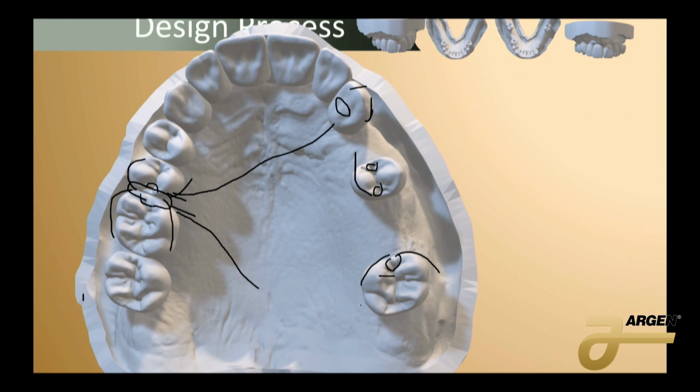On a case like this, I'll be honest, I haven't seen too many of these, and when you're getting into designing frameworks, I urge you to go online and look at some of the masters who have made YouTube videos. They have a lot of creative ways to make a nice major connector. I don't really think that every major connector has to have a serious name. We're just connecting the parts, right? So it doesn't necessarily have to be called a strap or a horseshoe. If we're designing our own cases, we just want to be nicely connecting all of the parts. So there are a lot of creative ways to make this more organic, to make this more flow when you have weird shapes like this, right?